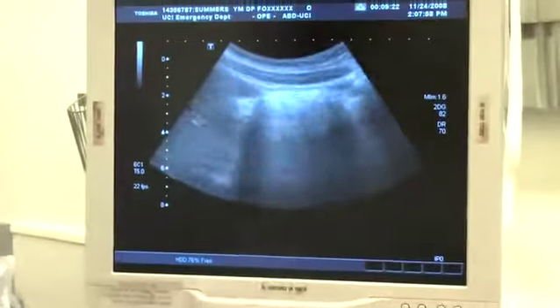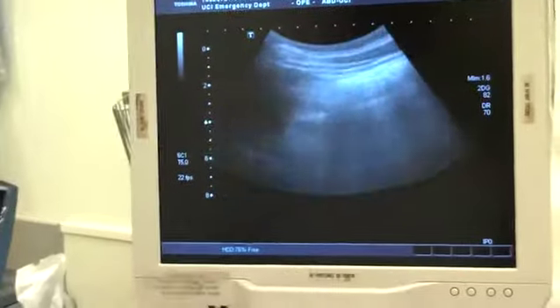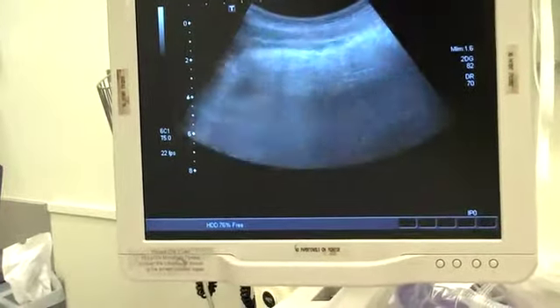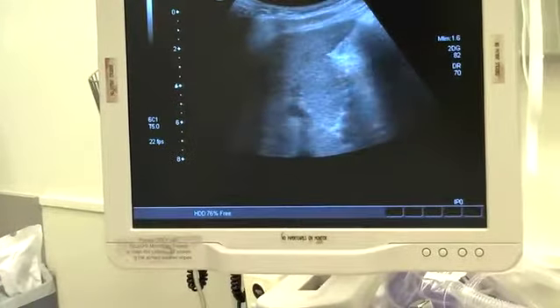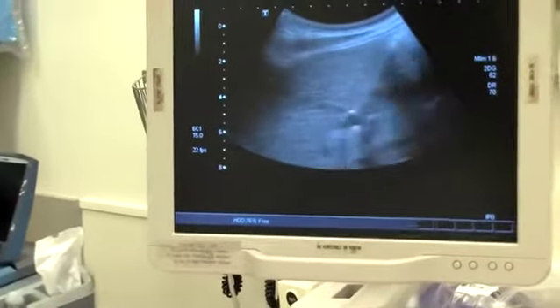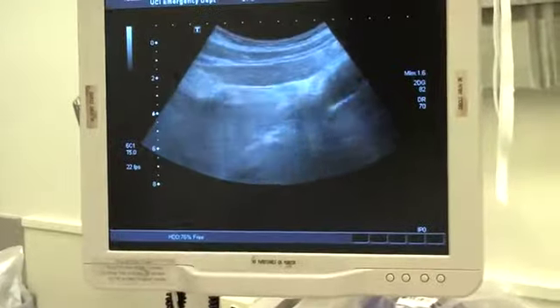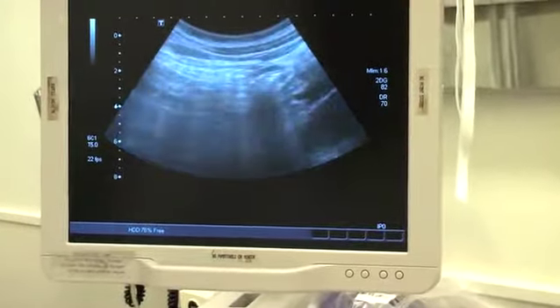So back to the gallbladder. Okay, so subcostal sweep. I'm going to sweep over. I'm going to have the patient take a deep breath. I've got the indicator to the patient's head, and I see the liver, and that's a good acoustic window here. Can you take a deep breath for me? There's the gallbladder coming to the screen here. Oopsies. Big deep breath. Deep breath and hold it.